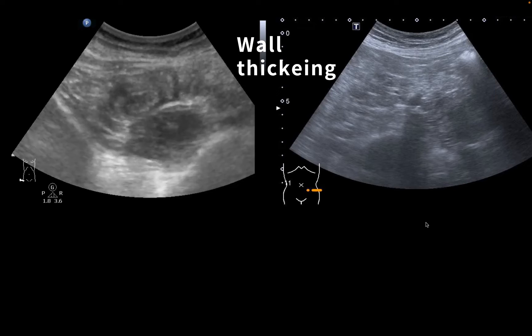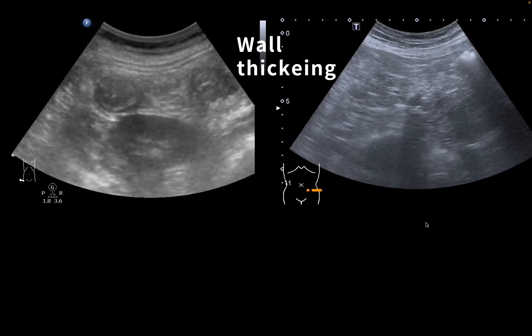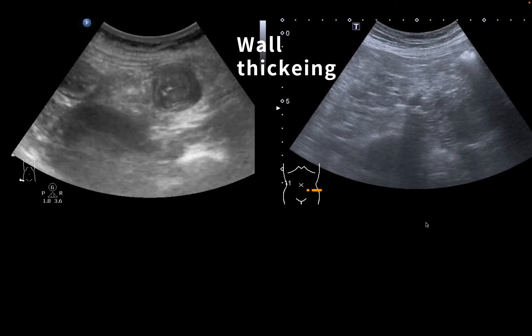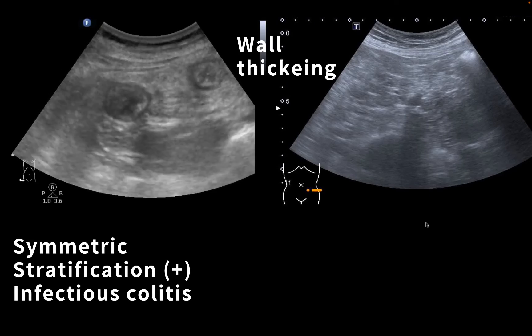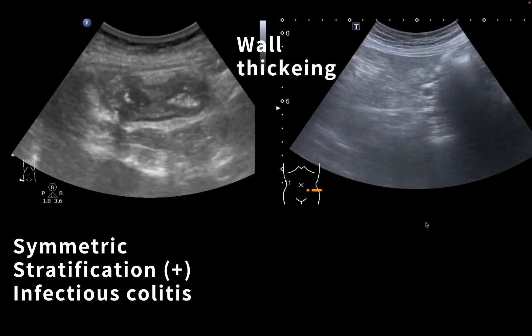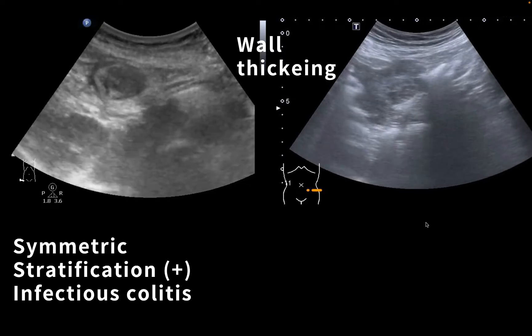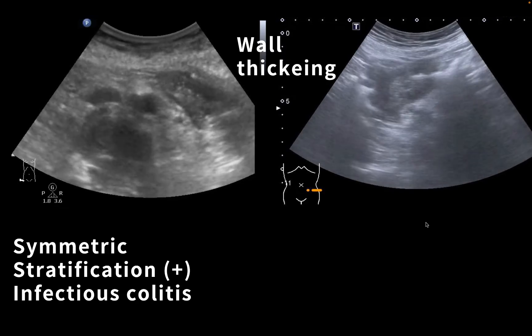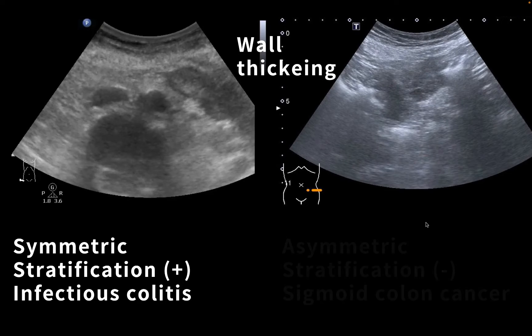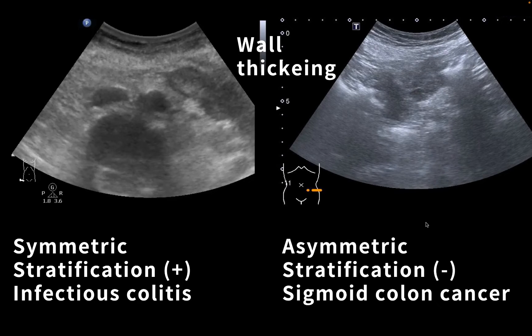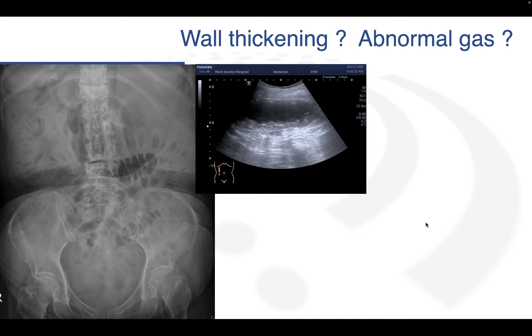Let's look at these two wall thickening comparisons. Wall thickening with preserved stratification and symmetric appearance is coming from infectious colitis. In this other patient, the sigmoid colon wall is thickened but it's asymmetric, and the stratification is not so clear. So when you encounter patients having asymmetric wall thickening without stratification, you should consider malignant growth. In this case, sigmoid colon cancer.